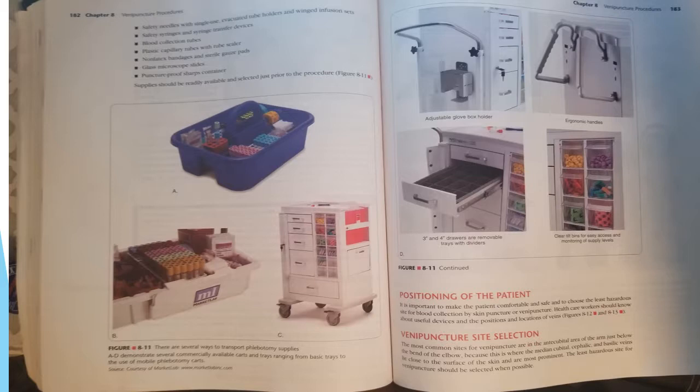Positioning of the patient. It is important to make the patient comfortable and safe and to choose the least hazardous site for blood collection by skin puncture or venipuncture. Healthcare workers should know about useful devices and the position and location of veins. Venipuncture site selection. The most common sites for venipuncture are in the antecubital area of the arm just below the bend of the elbow, because this is where the median cubital, cephalic, and basilic veins lie close to the surface of the skin and are most prominent. The least hazardous site for venipuncture should be selected when possible.